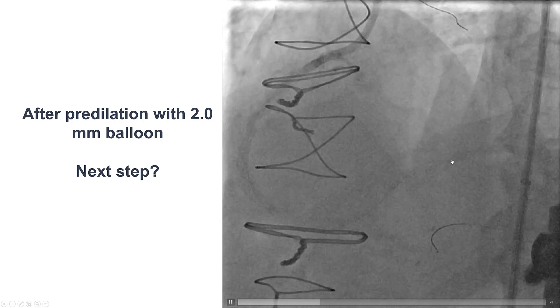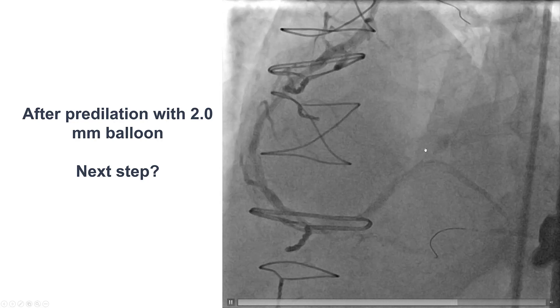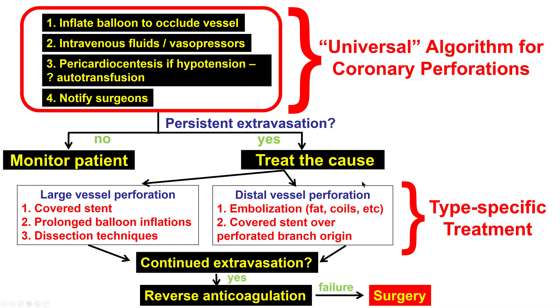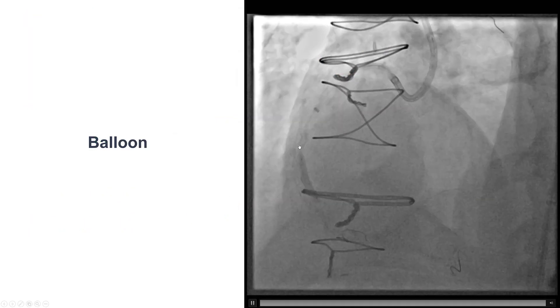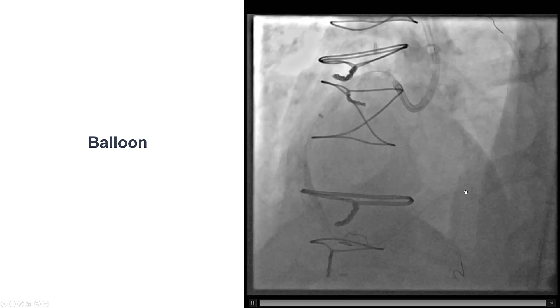Likely that polymer wire had gone into a small branch. So what to do next? This was a large vessel perforation. The first step is to inflate a balloon, and then for large vessel perforations, deliver a covered stent. Also, this being a bypass patient, there is concern for loculated effusions developing and causing compression of the cardiac chambers.